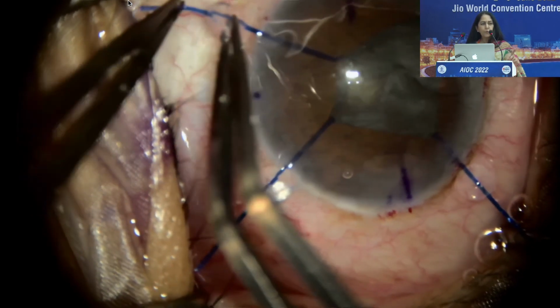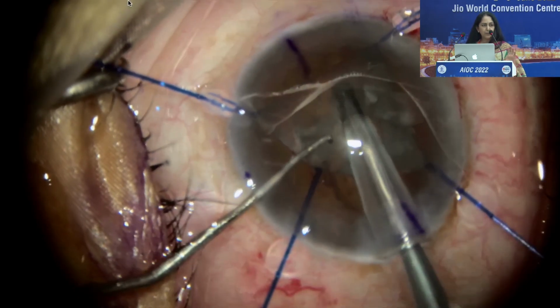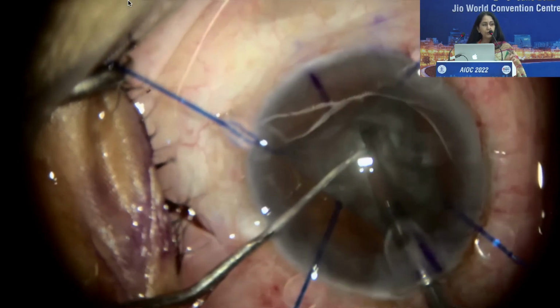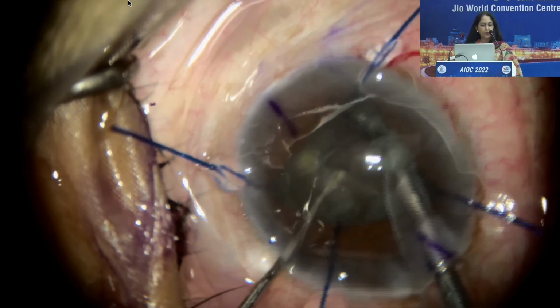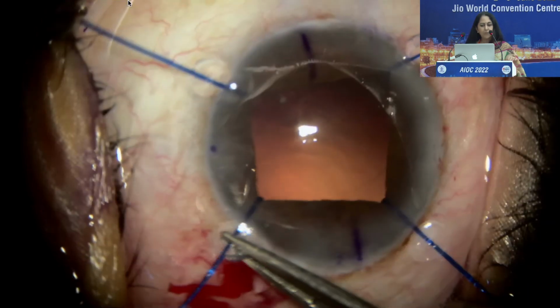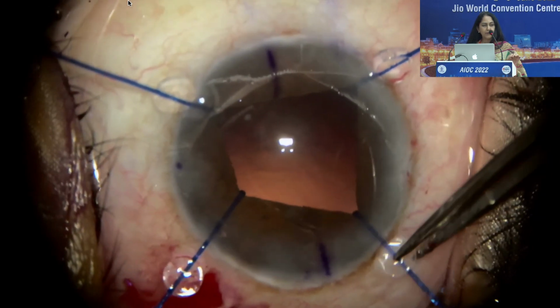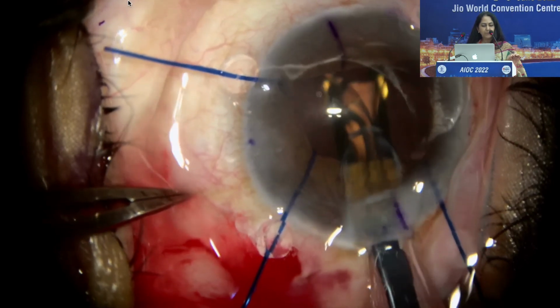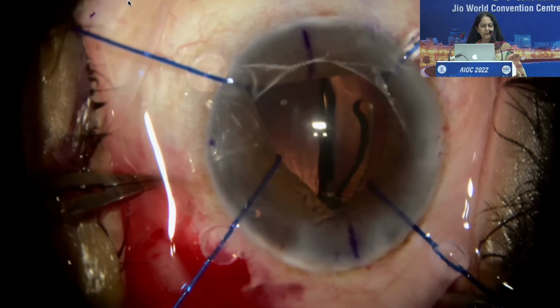And if you want to prevent this, because most people say that post-operatively, after the surgery, the pupil has not come back to its normal size. So a very important part is that you need to know when to stretch it and when to release it. At different parts of your procedure, you must release the iris hooks also. Don't just let them be where they are. You can release it like I released it now, because I don't want any incarceration of the iris tissue into the injector while I'm putting in the lens. And at this moment, it's quite a reasonable size dilatation of the pupil.